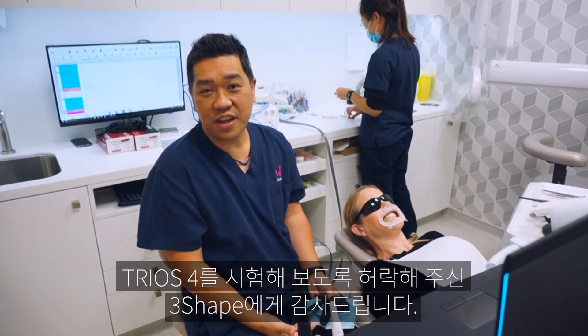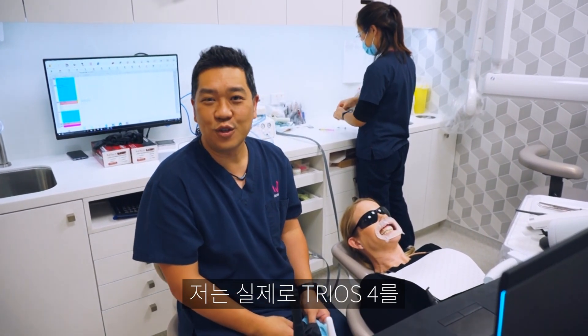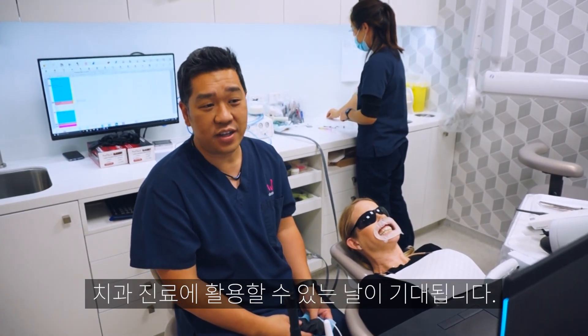It seems like a really good tool. Three Shape, thank you for letting me test drive this new Trios 4 — I'm really looking forward to having one in my own hands and applying it in my clinical practice.